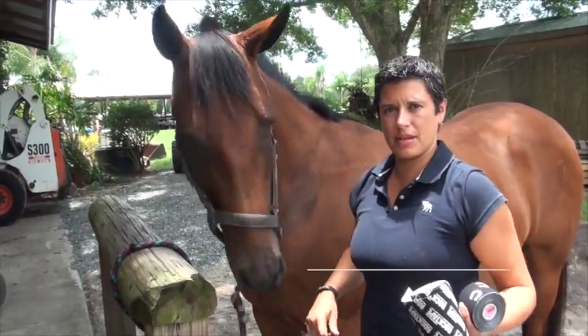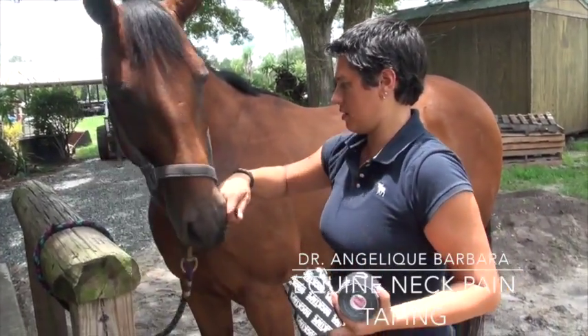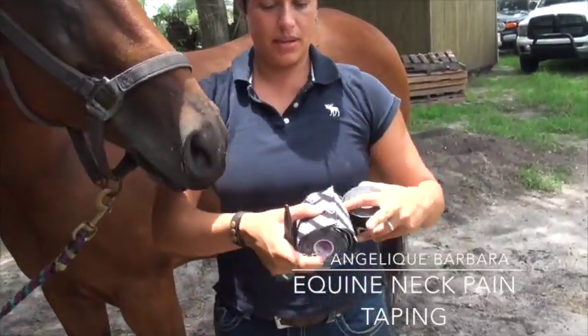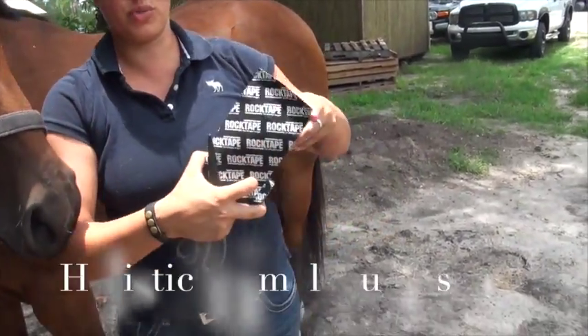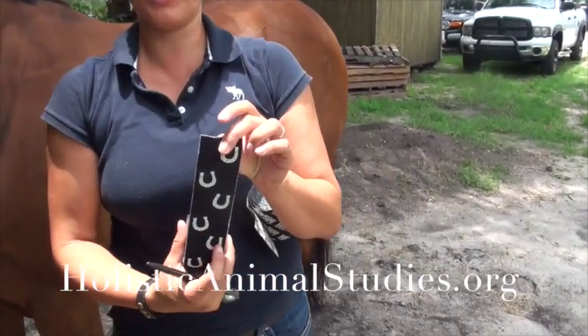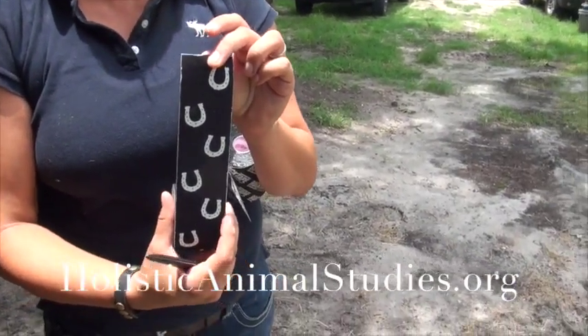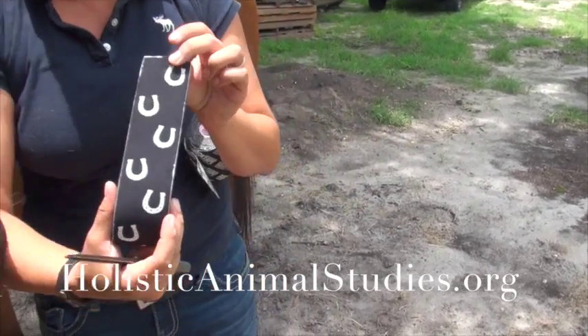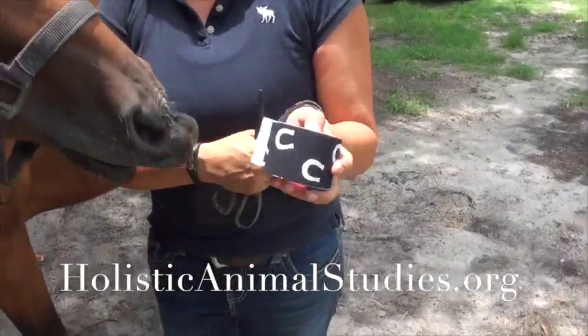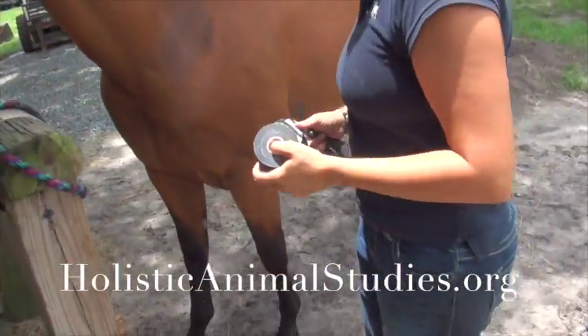I'm going to demonstrate some kinesiology taping on a horse. We have two different widths of tape. This is the Big Daddy — it's the 4-inch width. And this is the 2-inch standard, which also happens to be the equine tape that Rock Tape makes, made specifically for taping animals — it's stickier. We're going to use a little bit of this on Shea.